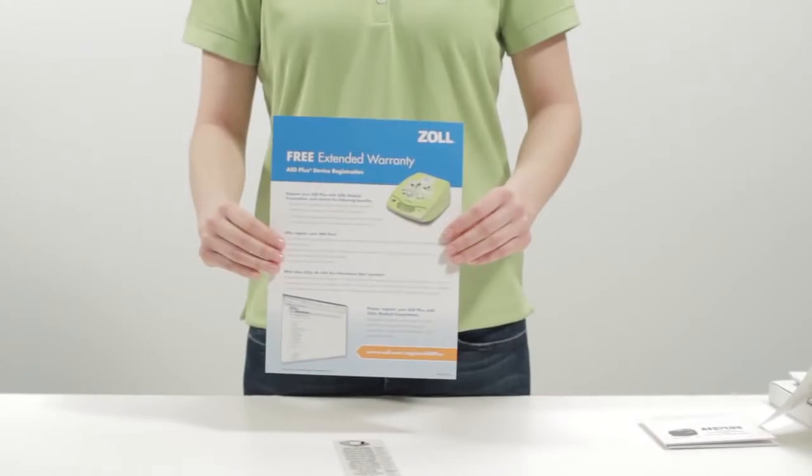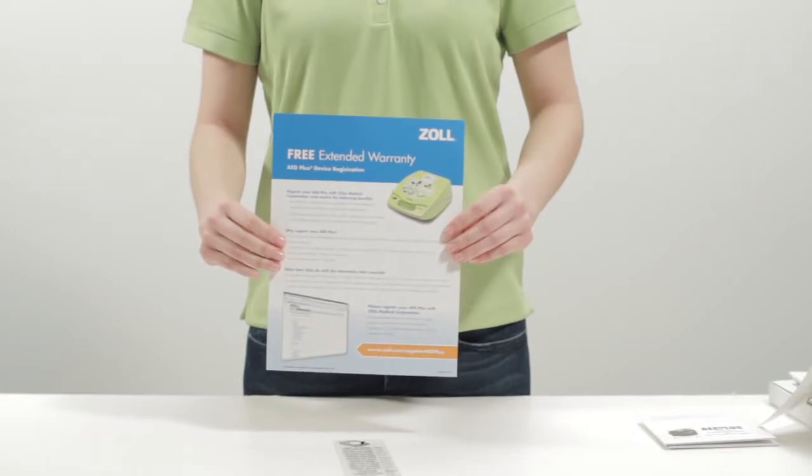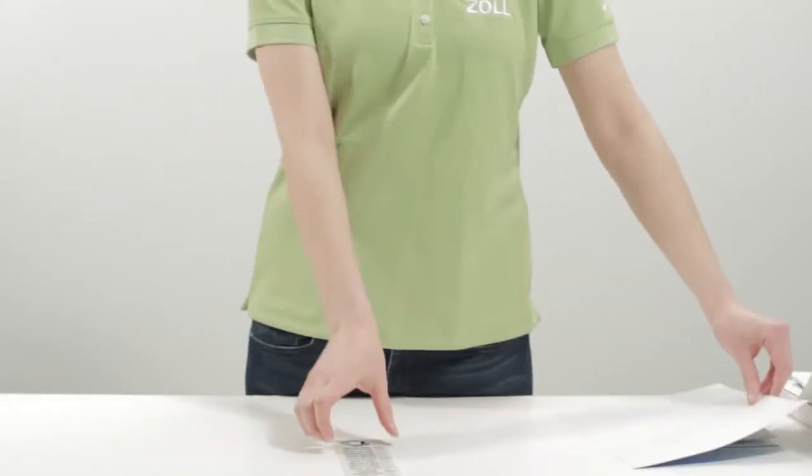Also included in the envelope is your device registration form. Use this form to register your device location online, which will extend your 5-year warranty an additional 2 years, giving you an extended warranty for a total of 7 years.